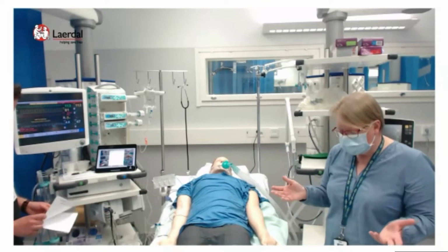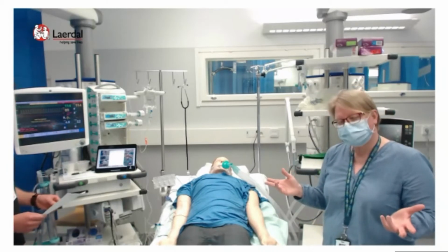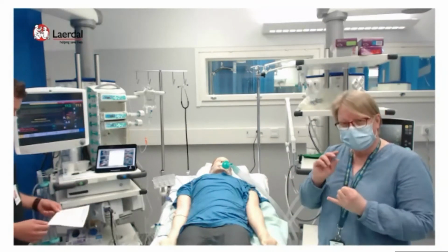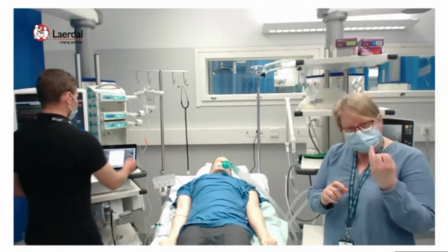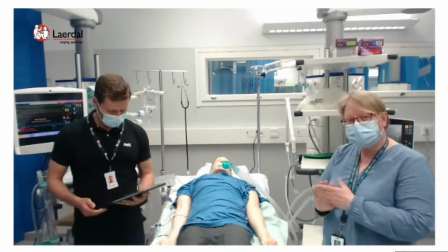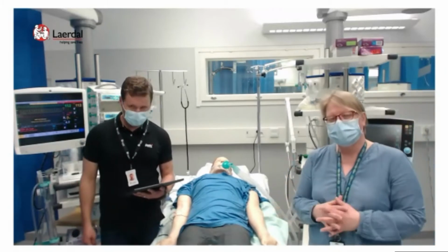So the question is for the participants or you behind the camera. So what would you do? Would you raise FiO2? Would you raise tidal volume, and how much? Would you change frequency, raise or get it lower? Would you give fentanyl? Would you give midazolam? And would you give rocuronium? And which amount of fentanyl, midazolam, and rocuronium would you give?